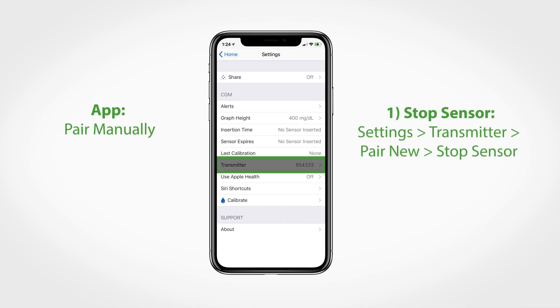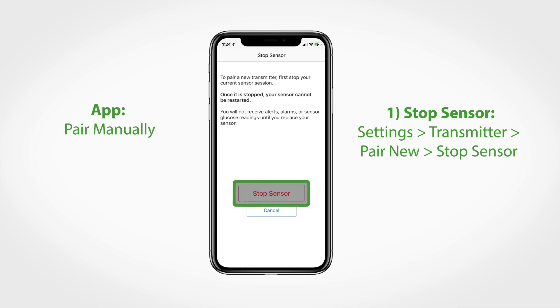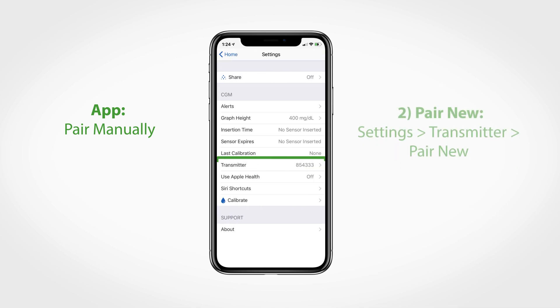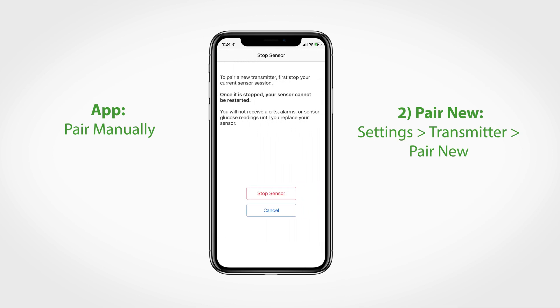To manually pair a new transmitter using your G6 app, stop your sensor within the settings option of your app, then tap transmitter and select pair new. You will be prompted to stop your sensor if your current sensor session is still active.